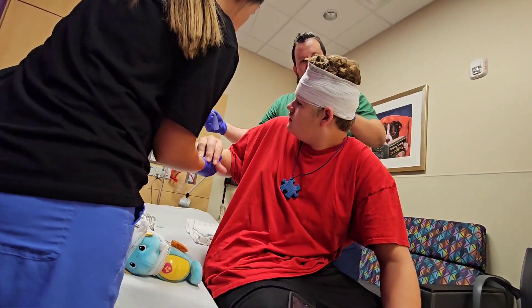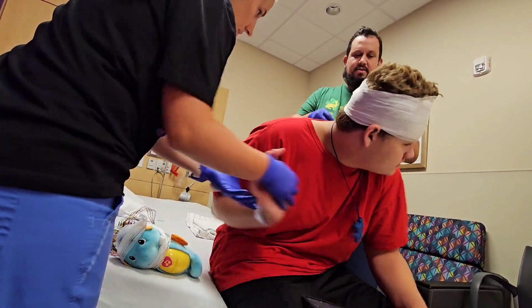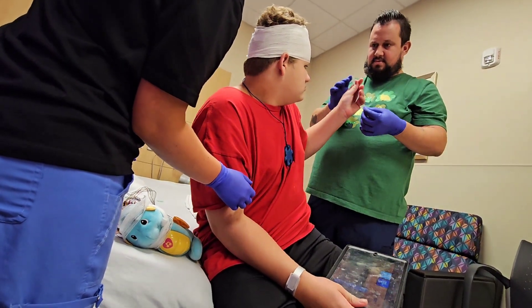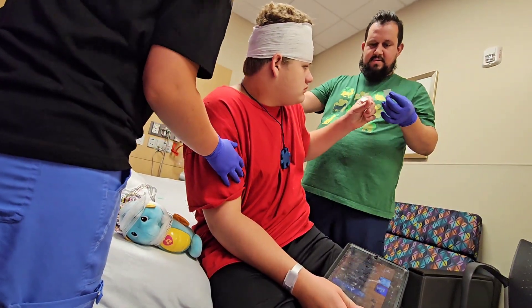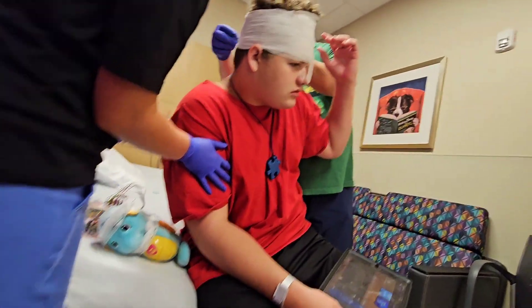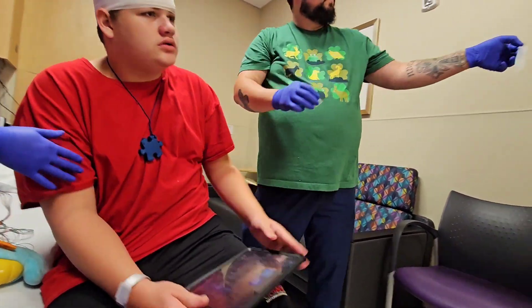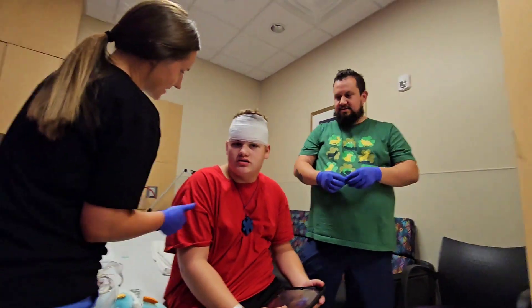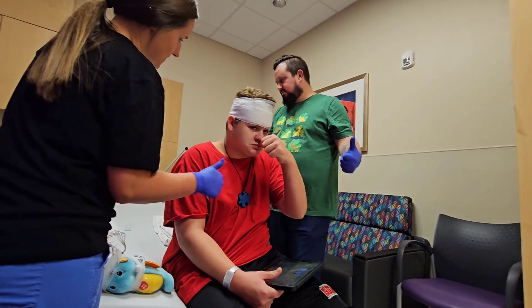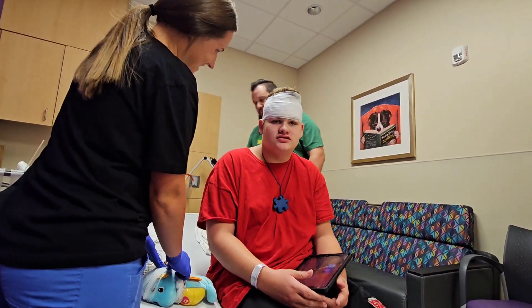No, no — watch, look, it just holds your hat on. It's just safe. Look at what's on your head right there — just hold here JJ. Look, hold it, touch it, it just holds your hat on in the back. Bobby, that's all. Help him put it on in the back, Bobby. Good job — there you go, see, there you go. You got it! There you go, good job. Thumbs up JJ, thumbs up — you're doing good!